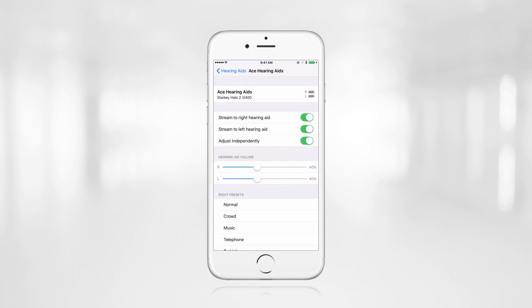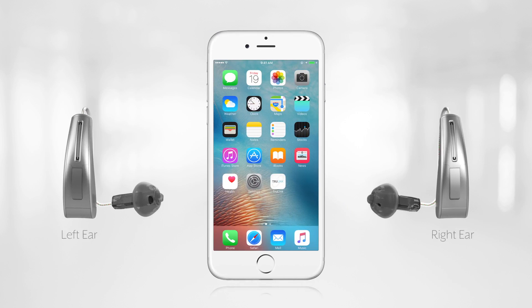Now the Halo devices are connected to the iPhone and are ready to be used with the TruLink app. It's as simple as that. One last note: Halo 2 hearing aids do have ear-to-ear control functionality.